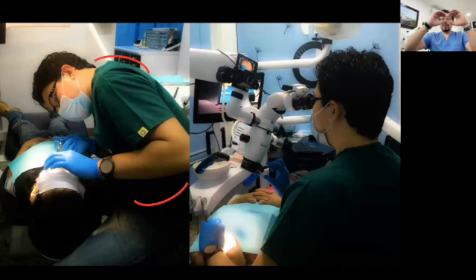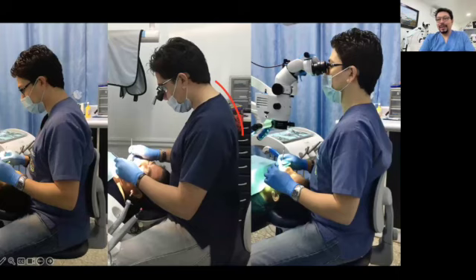You can keep your binoculars in a straight, horizontal position, and you can move your microscope from side to side. You have a little bit more freedom of movement, but it's just a small extra freedom. It's not like with the 3D, where you can move the optical pod in any direction.